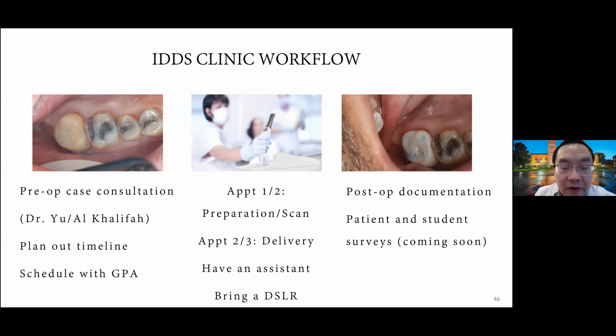A quick overview of the workflow itself. If you have already done a crown case on a patient with the traditional workflow on your own, we're not talking about second- or fourth-year crowns, we're talking about on your own, so you know the traditional workflow one time, then talk to us if you have a crown case.